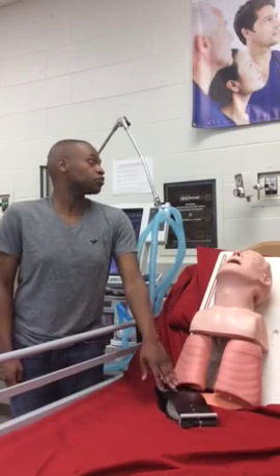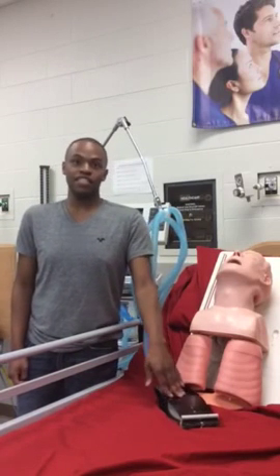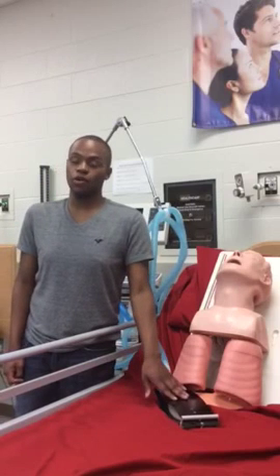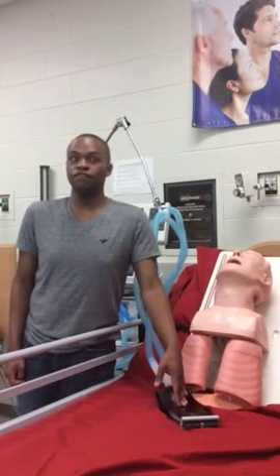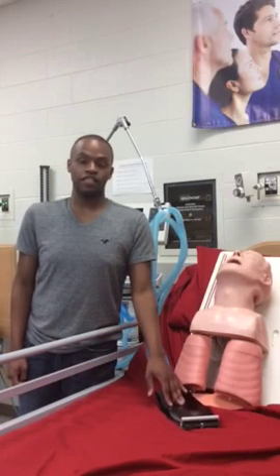So I look at her SpO2 on the monitor, and it's 90%. I look at capnometry, and it's 60. This is good because it's close to her baseline ABG of 55 for her PaCO2. She is ready to be extubated.